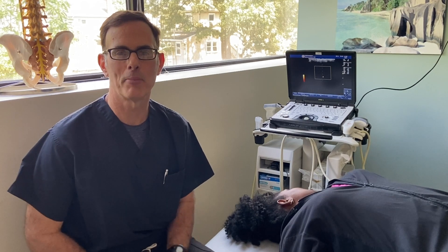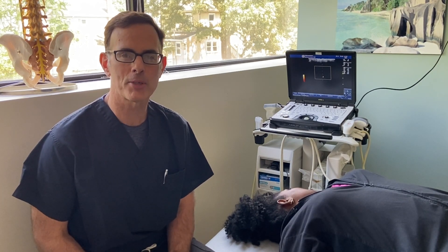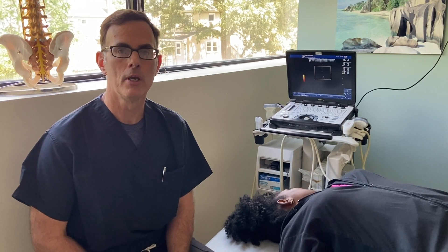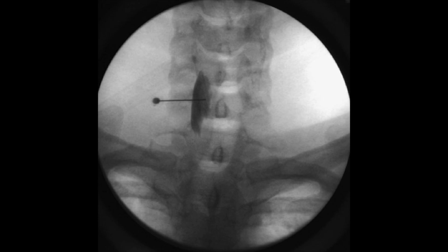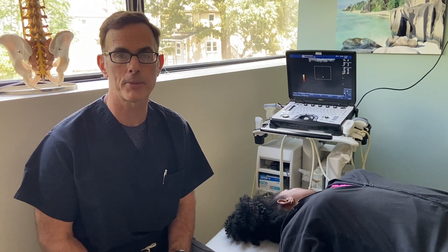These are two commonly used imaging techniques to perform this procedure. Fluoroscopy is live x-ray — a C-arm used in either an operating room or surgical suite that directs the physician's needle to a location on the side of the neck, which is where the stellate ganglion lies. This procedure has been the standard of care for many years, and many physicians are trained to perform stellate ganglion block under fluoroscopy.